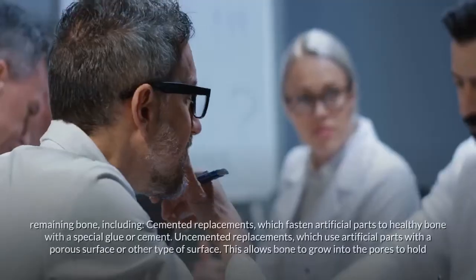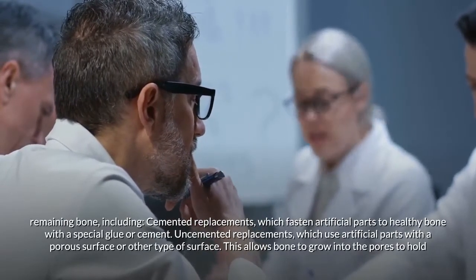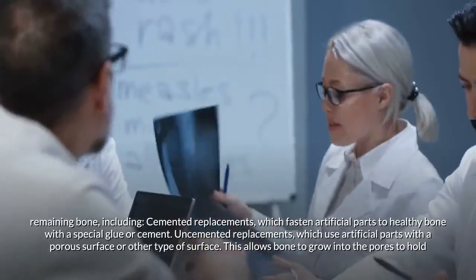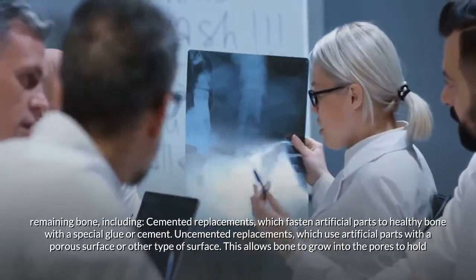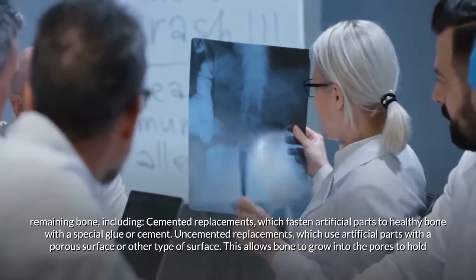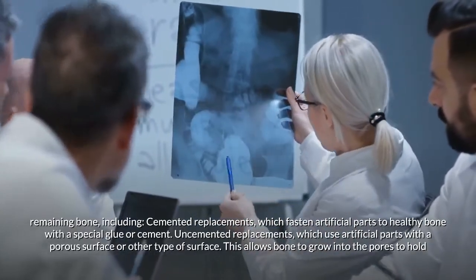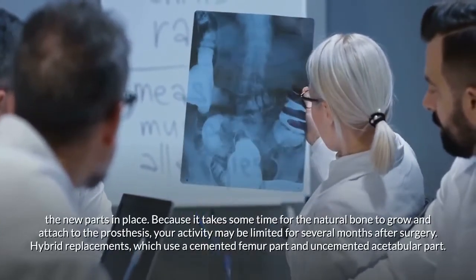Attachment options include cemented replacements, which fasten artificial parts to healthy bone with a special glue or cement, and uncemented replacements, which use artificial parts with a porous surface that allows bone to grow into the pores to hold the new parts in place.